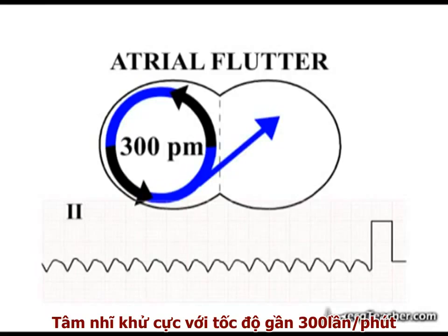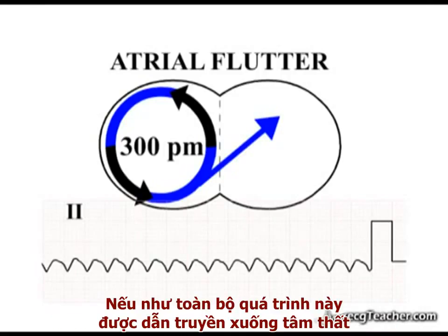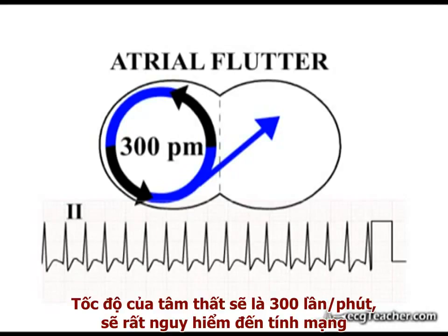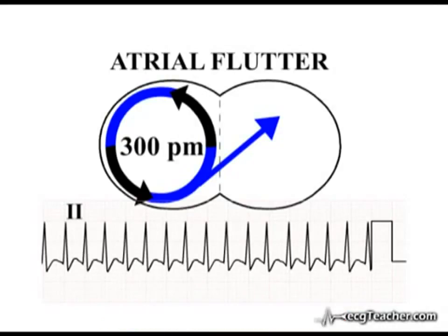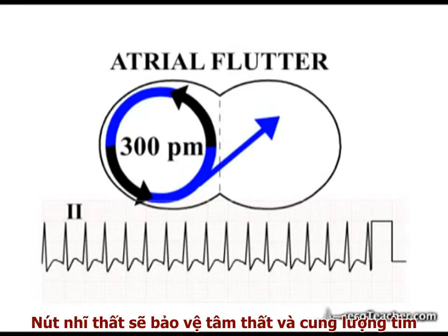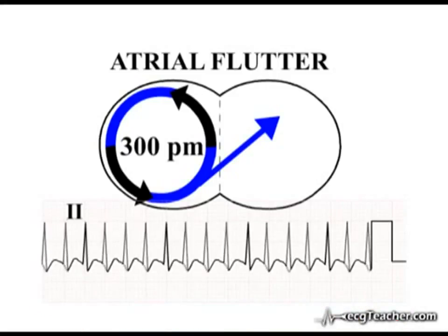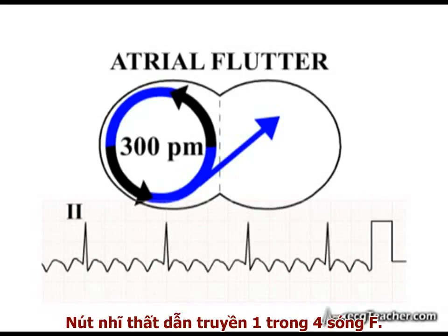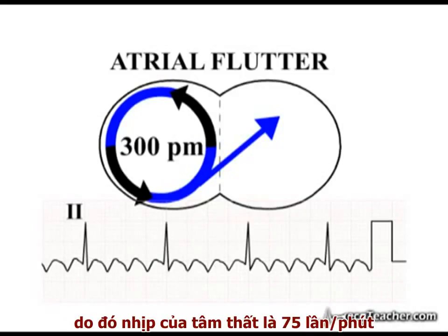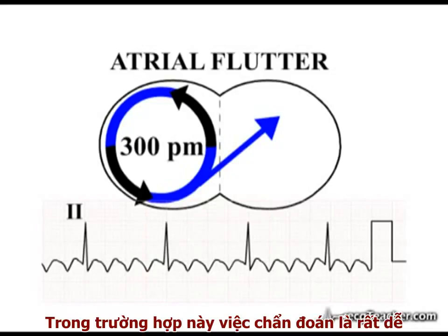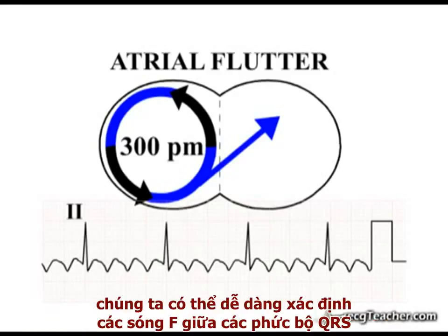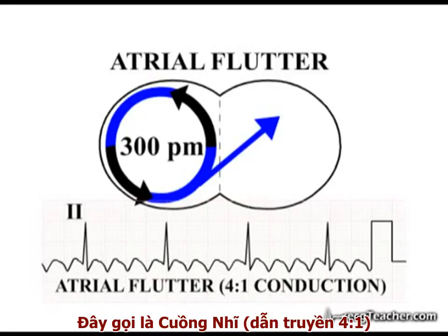The atria are depolarizing approximately 300 times every minute. If this were transmitted to the ventricles, a ventricular rate of 300 beats per minute would be potentially fatal, as the chambers fail to fill between beats. The AV node protects the ventricles and cardiac output by selectively blocking transmission of a proportion of flutter waves. In the example shown here, the AV node is conducting 1 in every 4 flutter waves, giving a ventricular rate of 75 beats per minute. We can easily identify the flutter waves between episodes of ventricular activity. This is atrial flutter with 4 to 1 conduction.